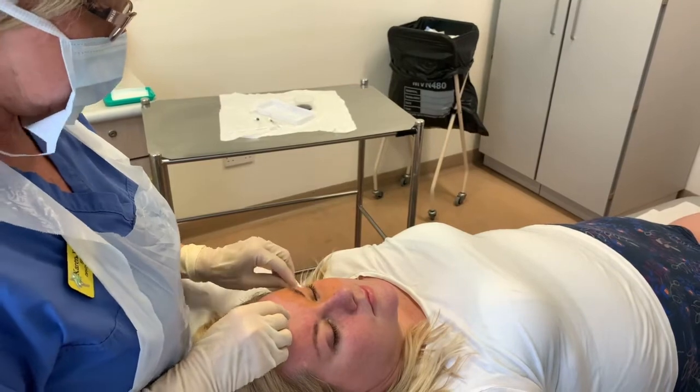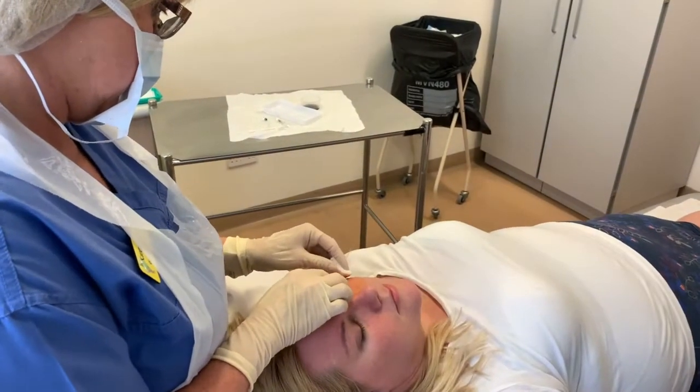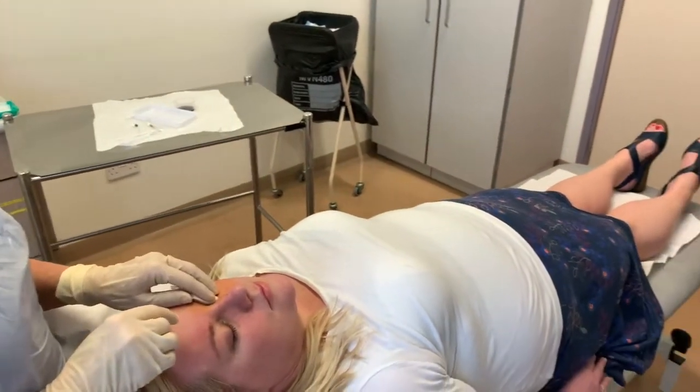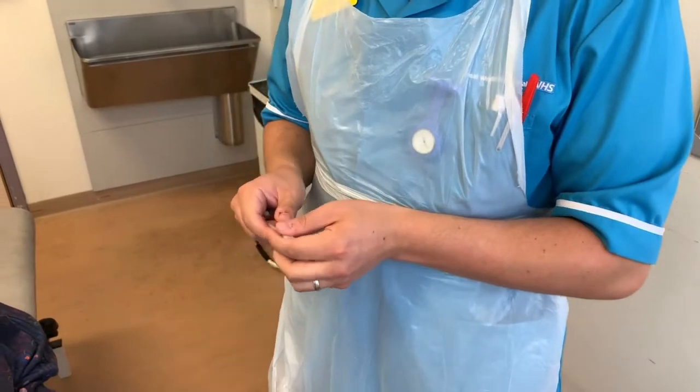And just look over to Ashley again. Just pop these lubricant, nice and relaxed, calmly. And which lubricant do you use there? Celluvisc, 1%. A whole ampule, we would give them a whole ampule.